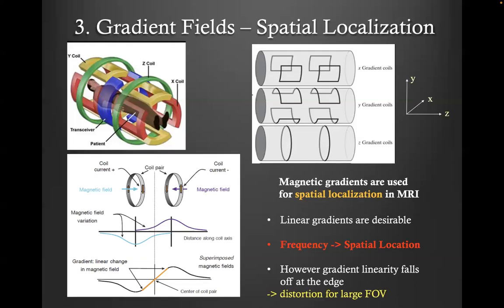So again, some additional details here. The linear magnetic field is ideal, but when it goes beyond that, you could have distortions because it's not linear anymore, but all your MRI signal encoding assumes linearity. So you're going to have distortions. Or if you have metal that's affecting your field, you're going to have distortions. That's beyond the point of this safety lecture, but just know that it's this magnetic field, and the frequency that all your protons are spinning at, that defines their spatial location.